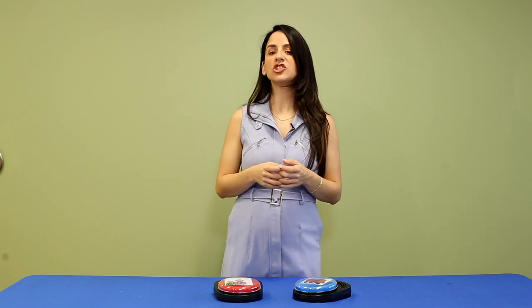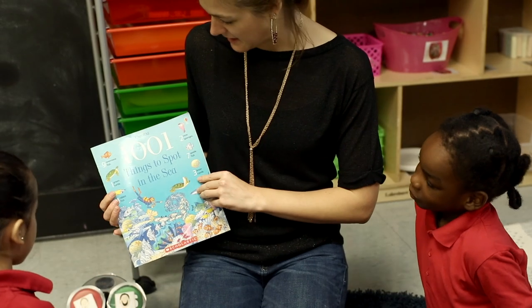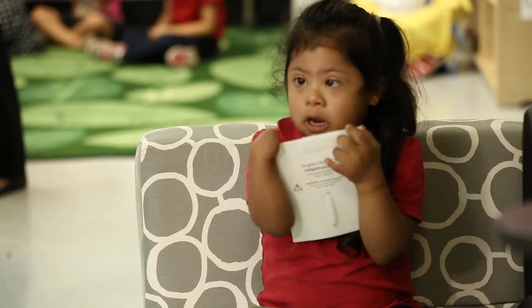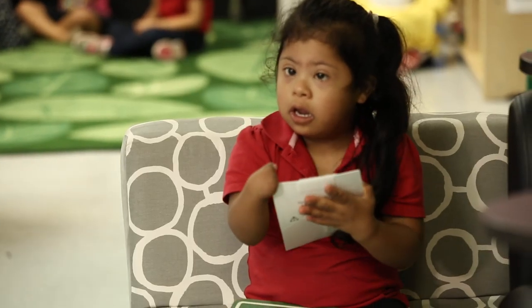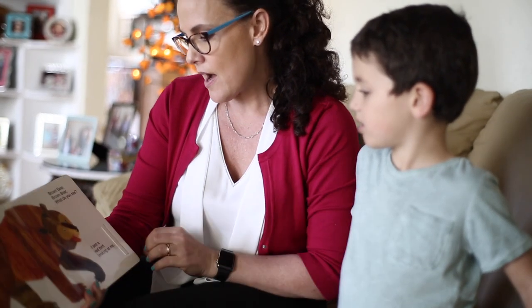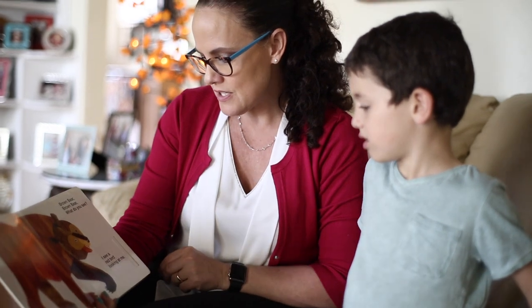For the following example, we want the child to participate more during story time, so we will be recording a repeatable line of a popular children's book: "Brown bear, brown bear, what do you see?"